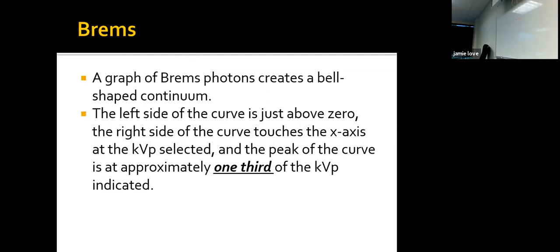The collimator has mirrors in it. That filters out a little bit of those X-rays. So we say a total of 2.5 millimeters of total filtration is in the tube. So we add slices of aluminum in the tube before those beams come out and hit our patient. We get rid of those low energies with that. So the magic number: 2.5 total filtration.